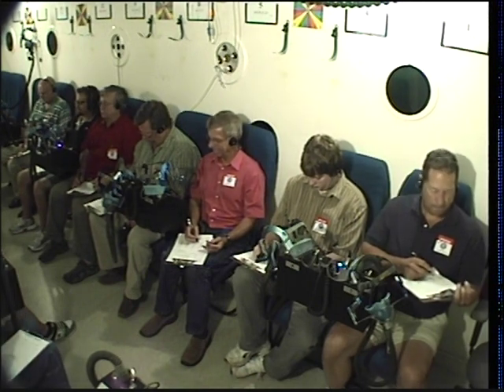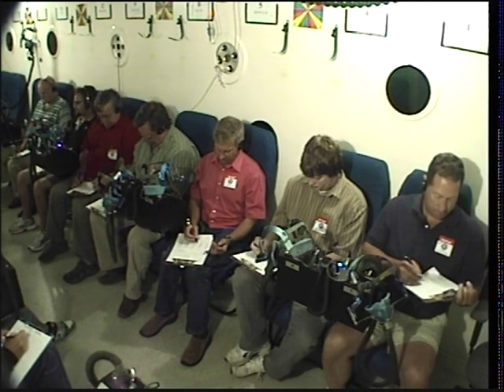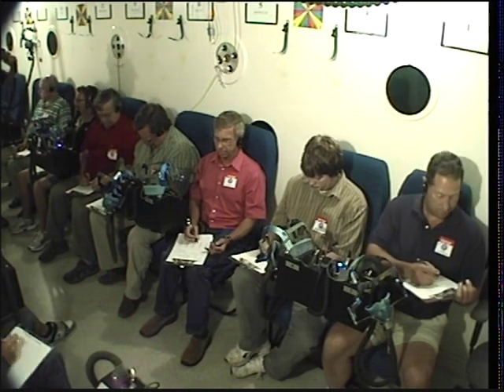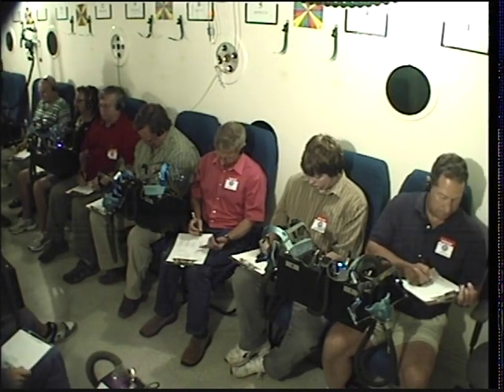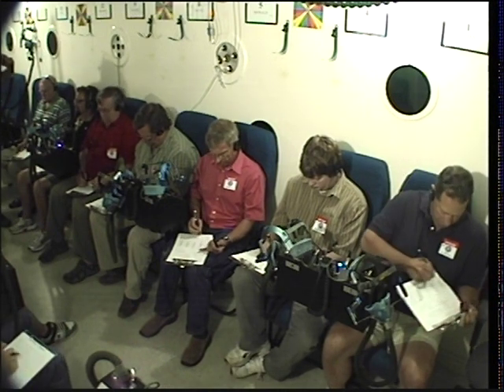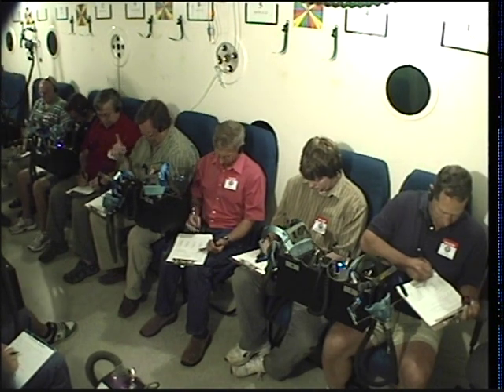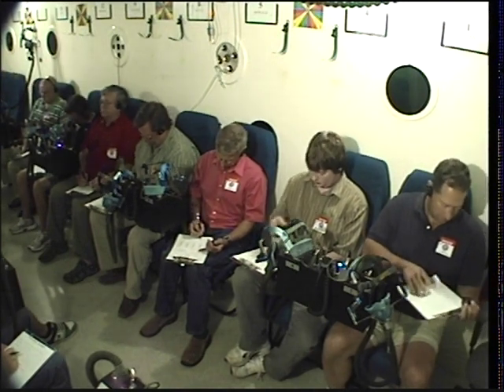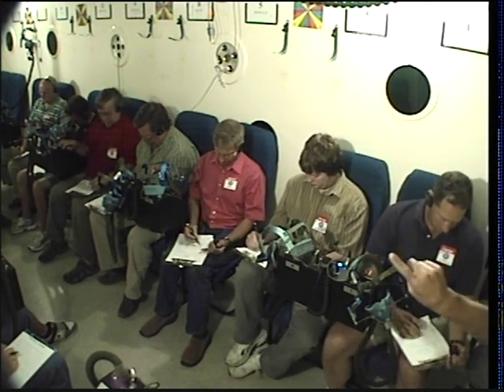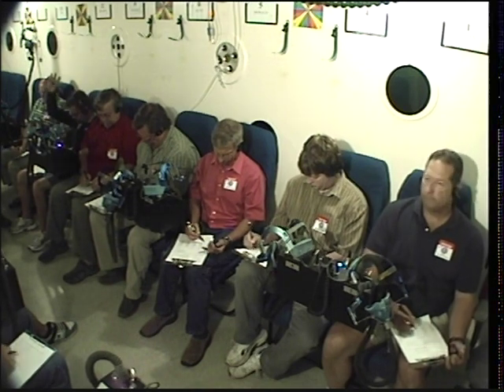We've gone past 1 minute, so if you would, go to item number 4. And I want you to put a check mark by any symptoms that you're experiencing, and then take a pulse oximeter reading and transfer that information down below that column. While you're doing that, Brian, how many symptoms do you have by show of fingers? 1. Benjamin, you have 2. Very good. Don, you have 1. Scott, 1. Tommy, how many symptoms do you have, sir? Just show of fingers. 1, 2, or 3. 2, okay. Brandon, you have 3, 4.